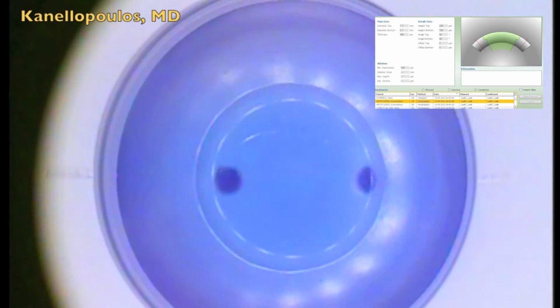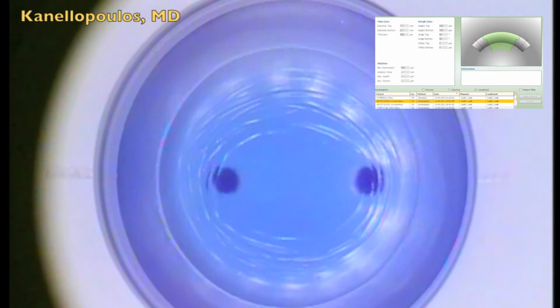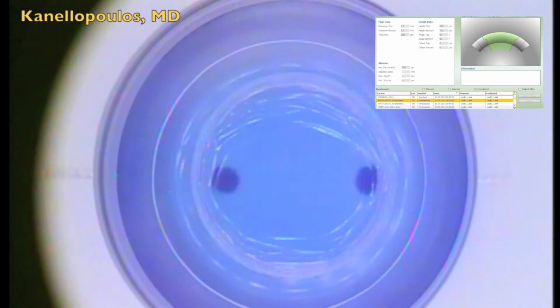We're going now to the donor, and we're using the Katena disposable artificial chamber. The donor cornea is fixated on the artificial chamber, and you can see now the donor trephination, seen in the top right, starts again on the endothelial side up. So some gas in the artificial anterior chamber, the step of the mushroom approach, all the way up to the epithelial layer.